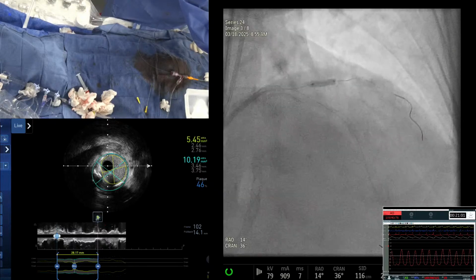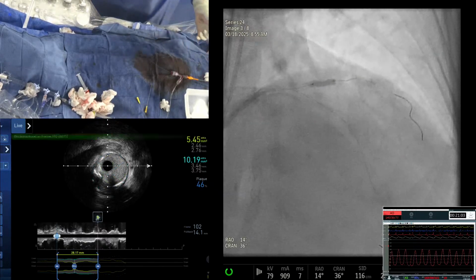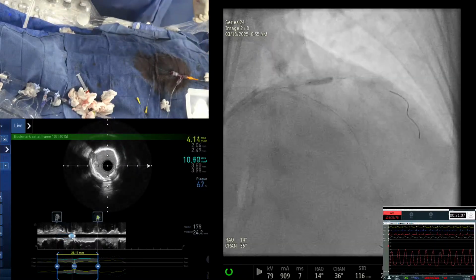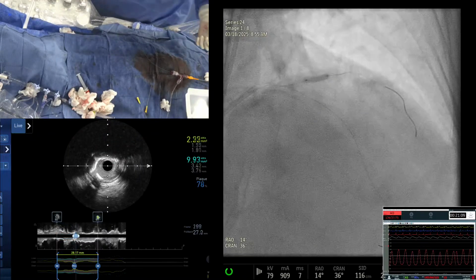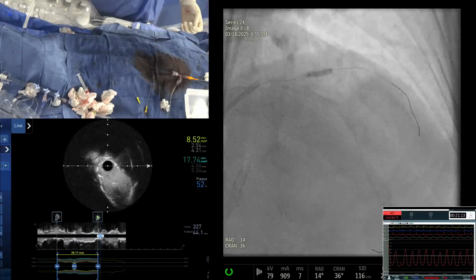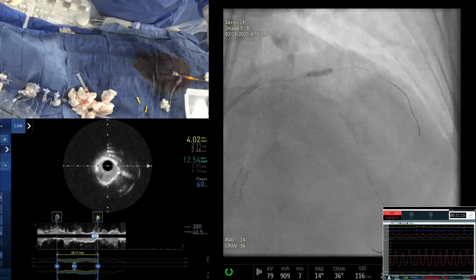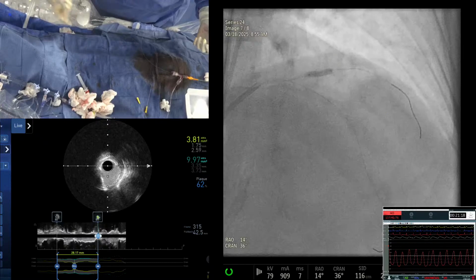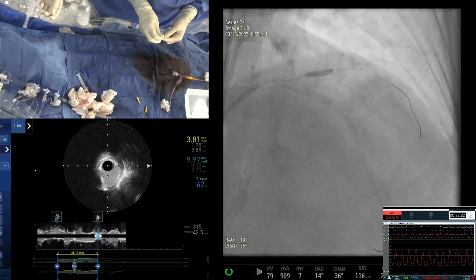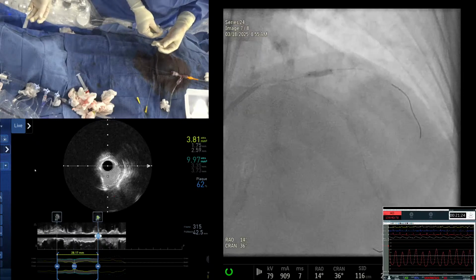We dilated it. It looks good. Okay, give me a quick 3.0 cutter. And then that means we have to put a 28 stent in the diag if we are coming up to the ostium. Right? Yeah, sounds good. And then we'll take a 3.5-23 from the LAD to not the ostium but mid left main. Okay? Yeah, sounds good.